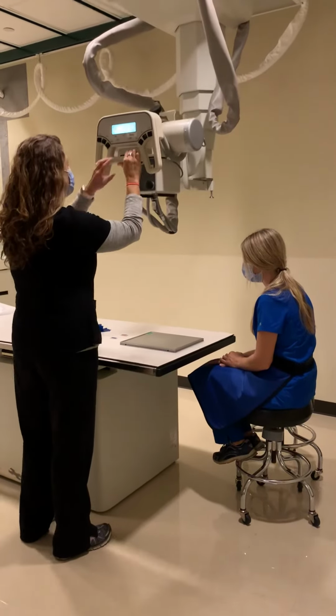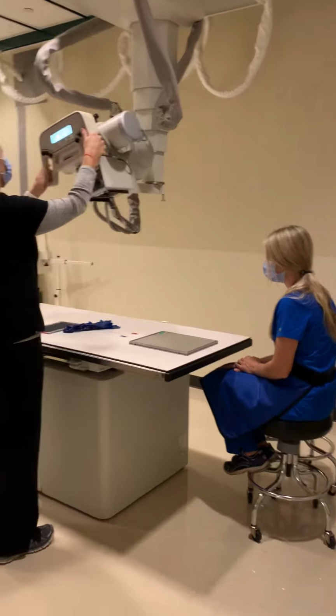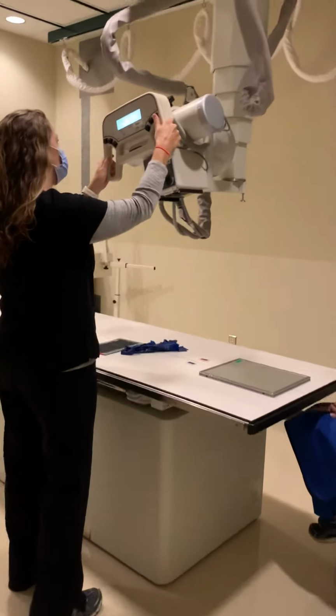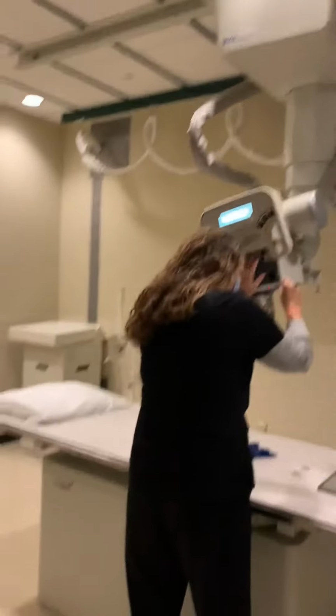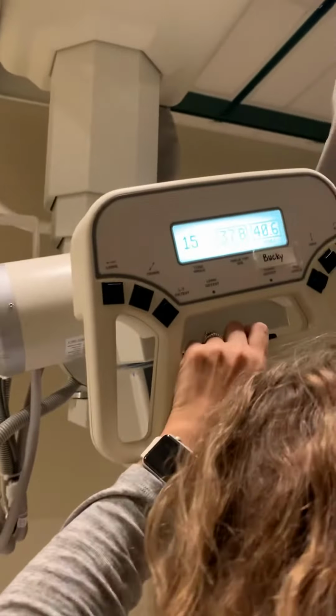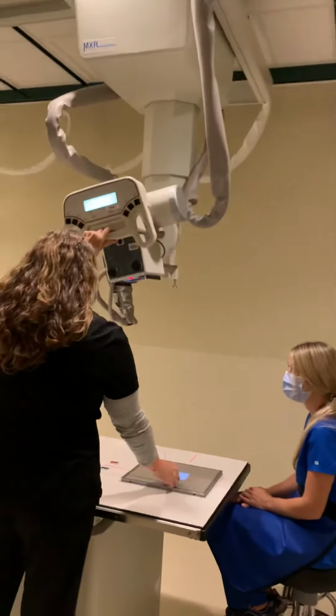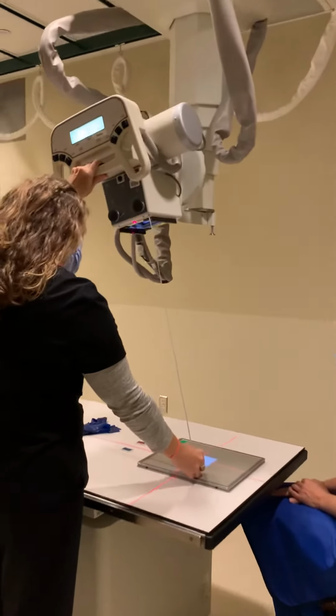Today our technologist is going to demonstrate two specialty views of the wrist. The first being the PA scaphoid, or known as the navicular, with ulnar deviation. Our patient is seated at the end of the table with lead shielding. We have a 10 by 12 lengthwise. We're going to center to the center of the image receptor.